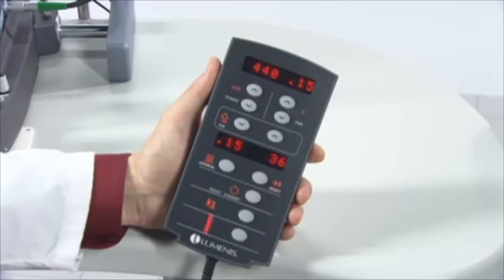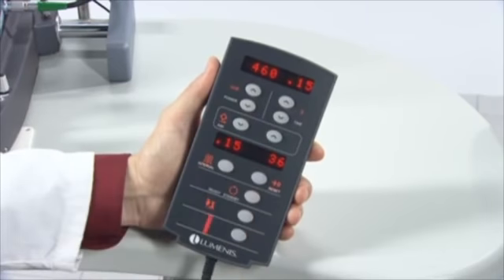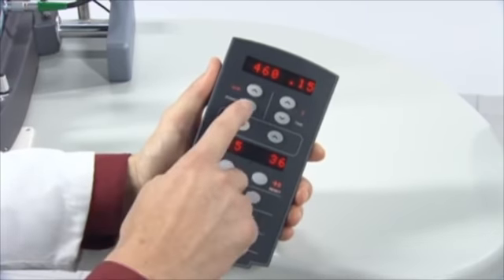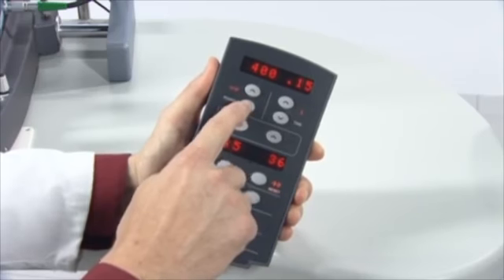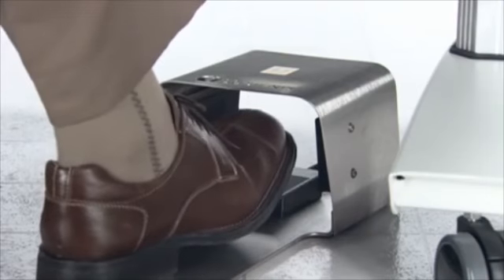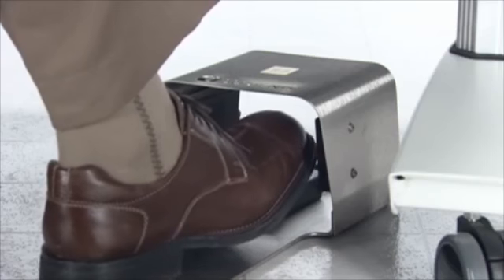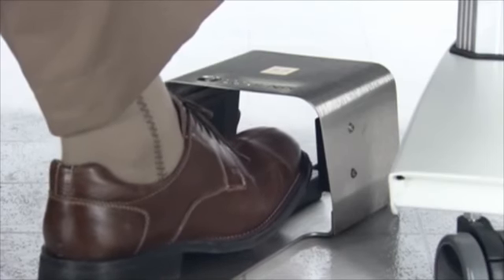To set the power from the remote control, press the up (increase) and down (decrease) selectors in the field until the desired setting displays. If you are using the Power Ease foot switch, you can also adjust the laser power by pressing the switches on the inside left (decrease power) and right (increase power) of the foot switch housing.